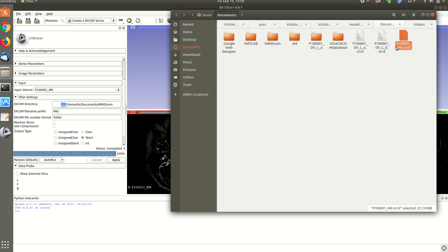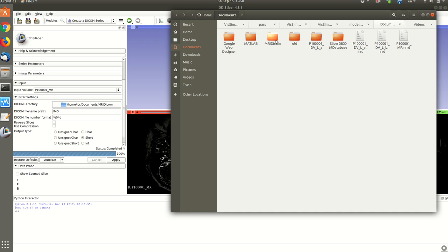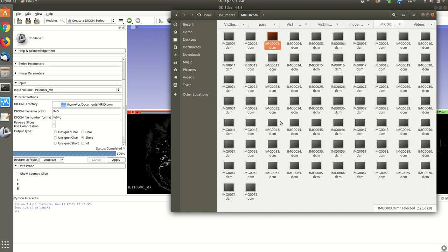So if you go to the documents, my documents, you can see here MRI DICOM, the one we just created.